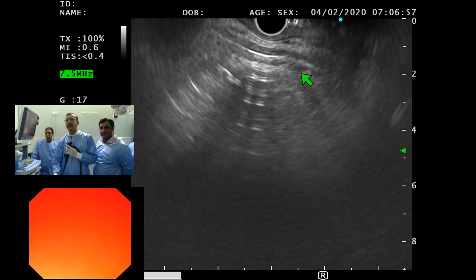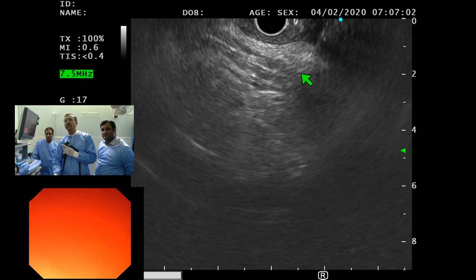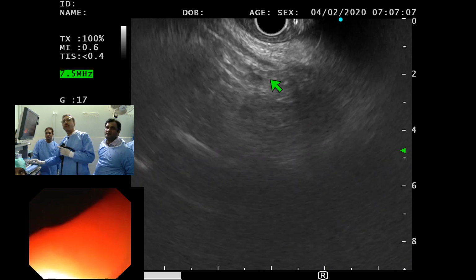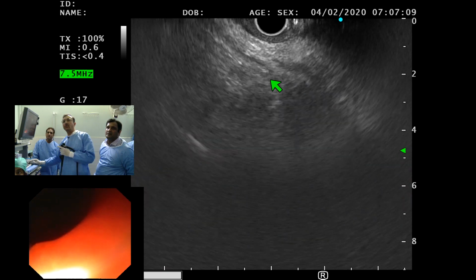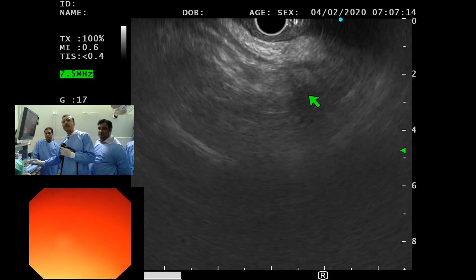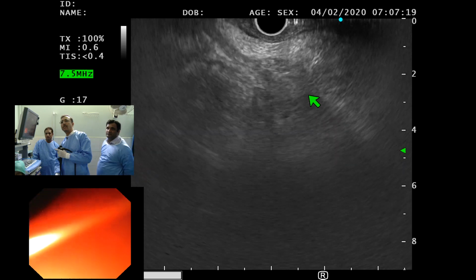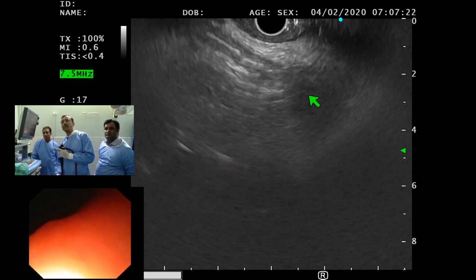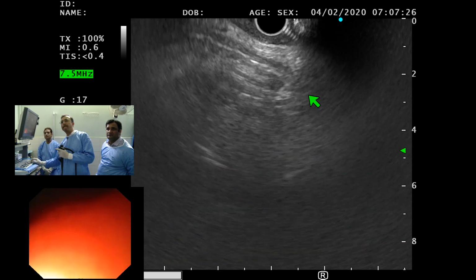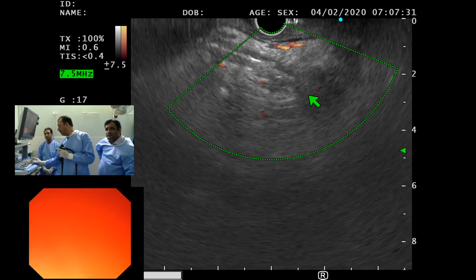Here we follow the stent and we are following the stent down. This is the stent. I'm just trying to rotate my shoulder, and I'm going down like this into the pancreatic head. We can't appreciate the stent lines as well as I'm sure you can from there. Can you see now? We can only appreciate one line. Yes, this is the stent.